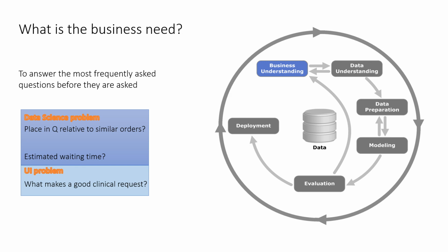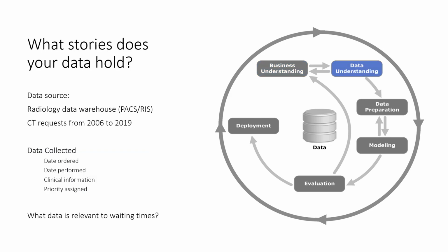Then we've also identified that clinicians don't know how to do a clinical request. This could just be solved by changing the user interface and providing that information at the time of inputting an order.